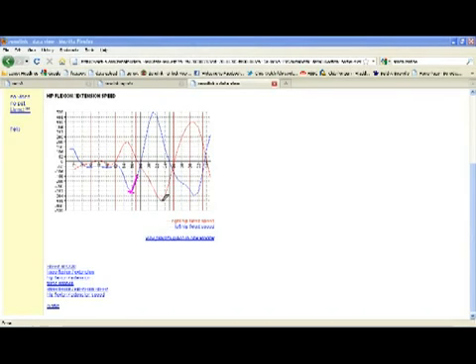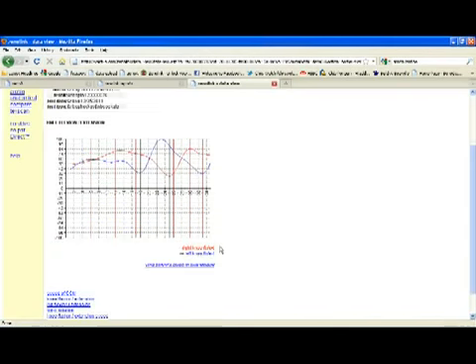When we look at the right side, we see speeds now up in the 400s, which is much better, but again, fairly limited flexion. And here on the left side, we have an extension speed of about 360, again with limited flexion. So we've got the same problem at the hip as we did at the knee, and that is output both at extension or push as well as flexion or pull. And then we've got a little bit of a patterning problem in that we're not getting good flexion prior to toe off.